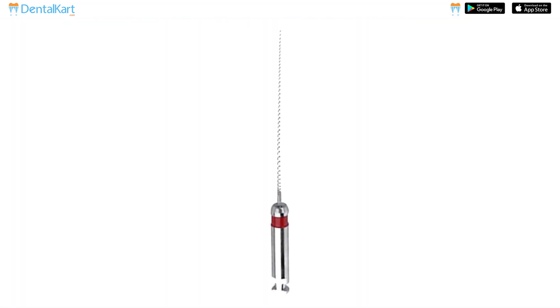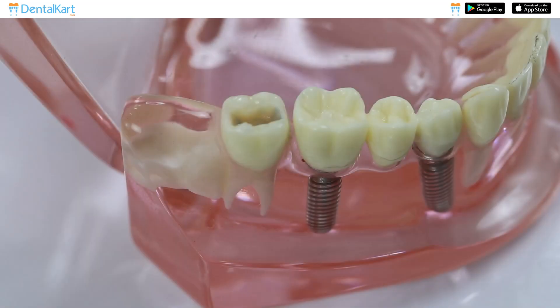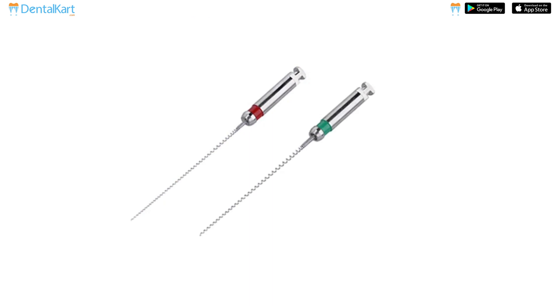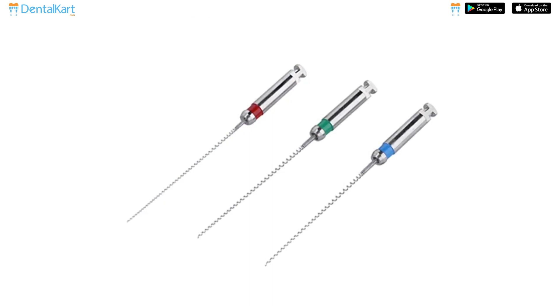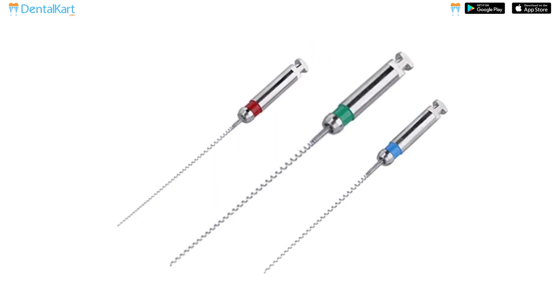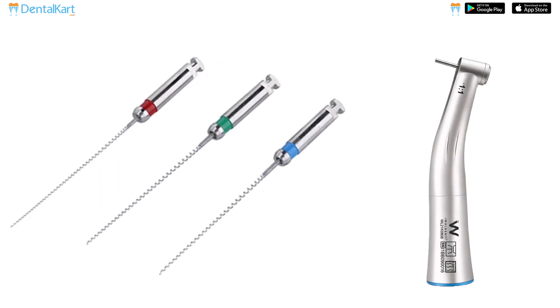Before using the Walden Paste Carrier, ensure that the access cavity is adequately prepared and the canal is clean and shaped properly. Choose the appropriate size based on the canal's dimensions and the desired obturation material. Attach the selected paste carrier to a slow-speed handpiece, ensuring a secure fit.